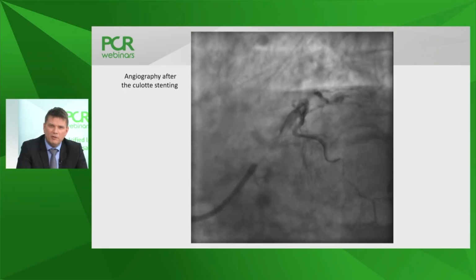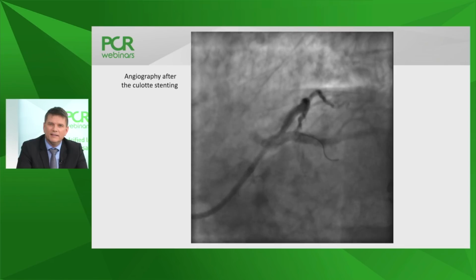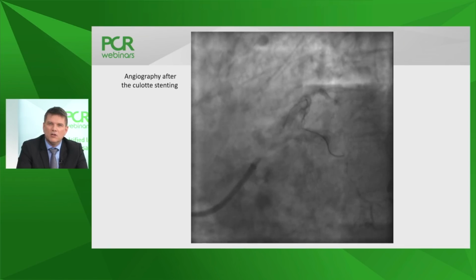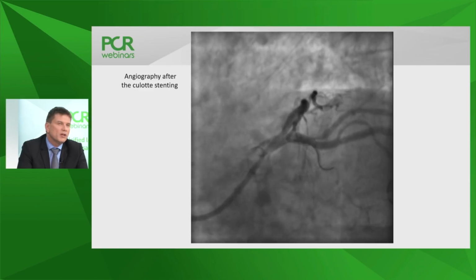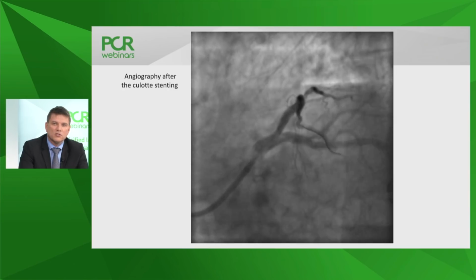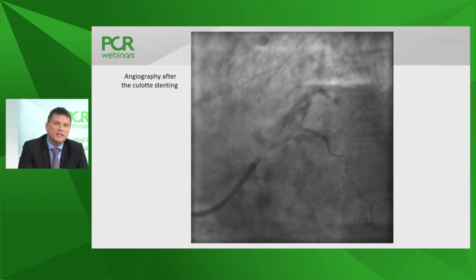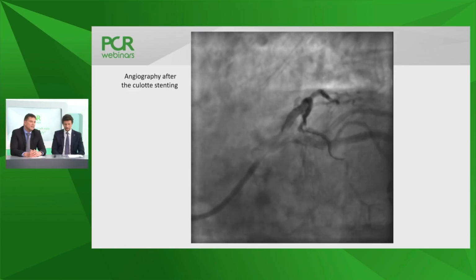Chris, this is the angio result after placing the stent in the LAD. What would you do more here? Well, I think it looks very good on the circumflex already. Honestly, I think the LAD looks still a little bit underexpanded. So I think we should try to optimize. I use the POT also in this setting, but definitely a kissing, and go with at least 3.5 millimeter in the proximal LAD.